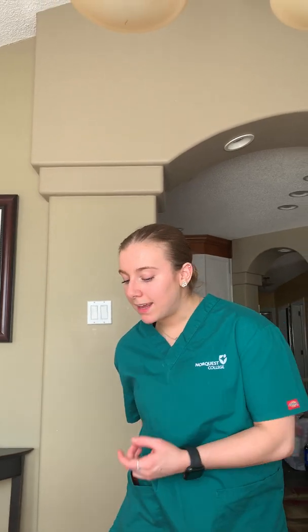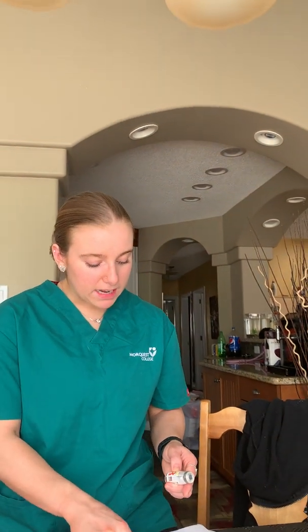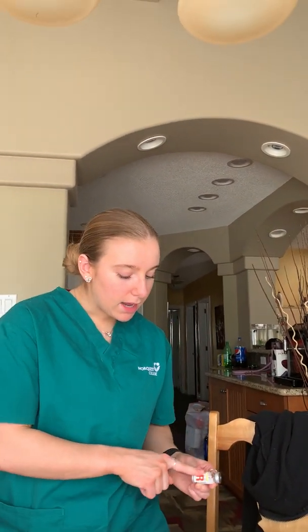So I will first grab the medication. Go into my medication drawer and I will grab the insulin Humulin R. I will then do my first check with the 5 rights. So first check here, we have right patient, Roger Stevenson. We have right medication, Humulin R. We have right dose, which is going to be 12 units. The right time, 8 a.m., and the right route, which will be subcutaneously.